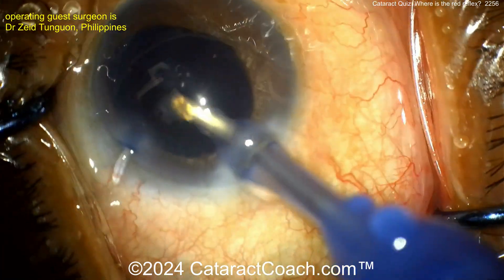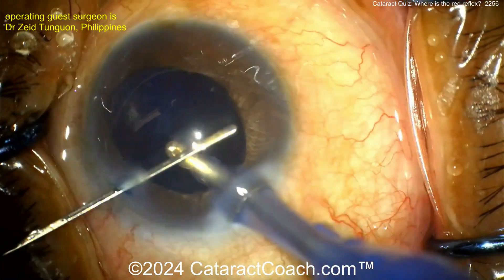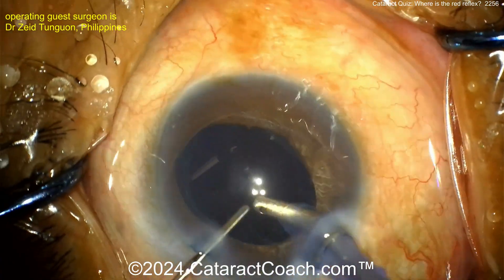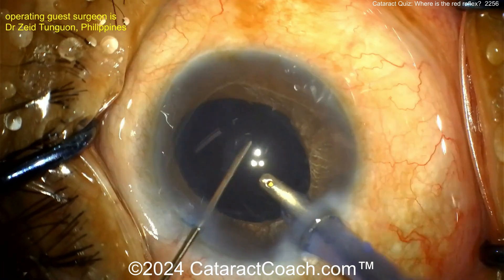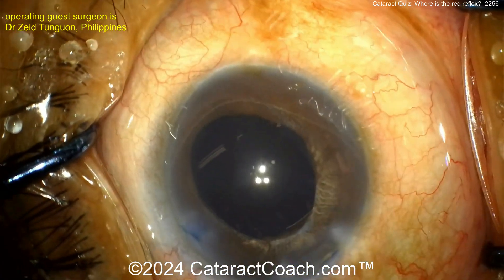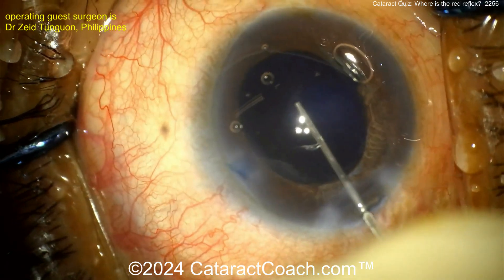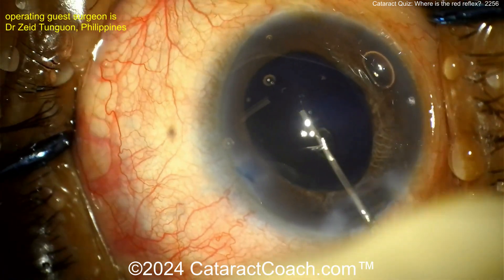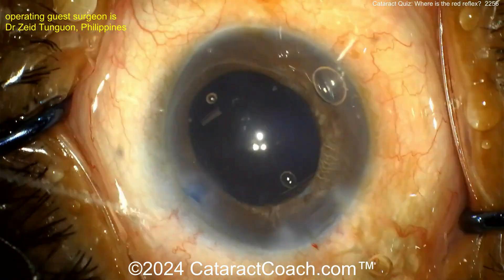Is there traumatic issues? Probably. Is there zonular weakness? Hard to say at this point. Should you put a capsular tension ring in right now? Maybe — there's probably no downside. You can obviously see the blue dye went through the zonular support somewhere into the vitreous cavity, so if you can get enough of a view to put in a capsular tension ring, that's probably a good idea, though not absolutely mandatory.